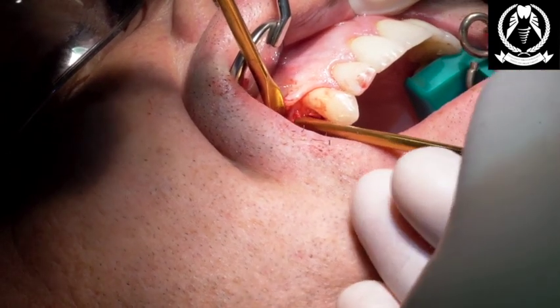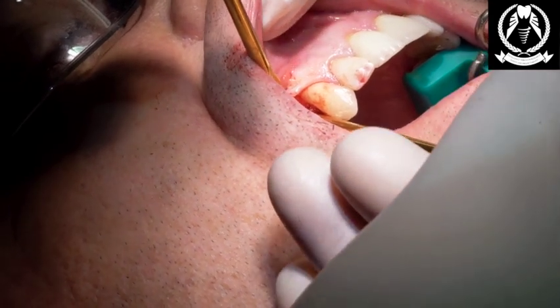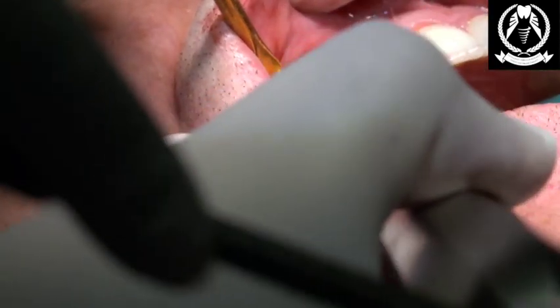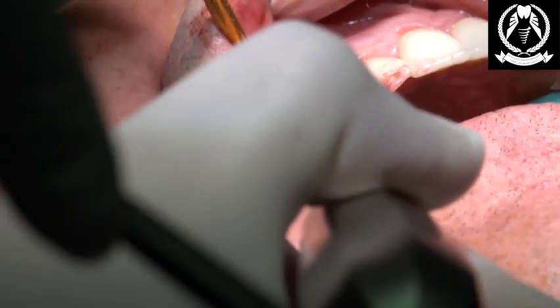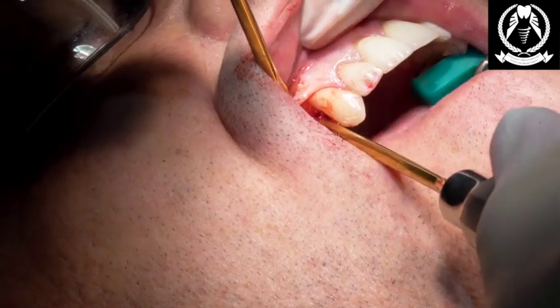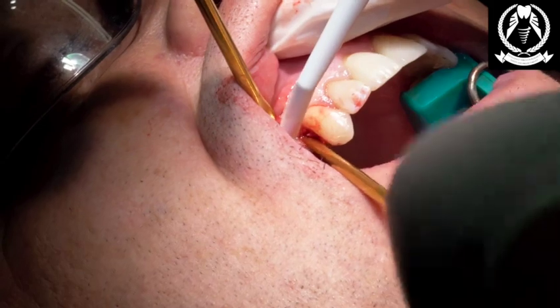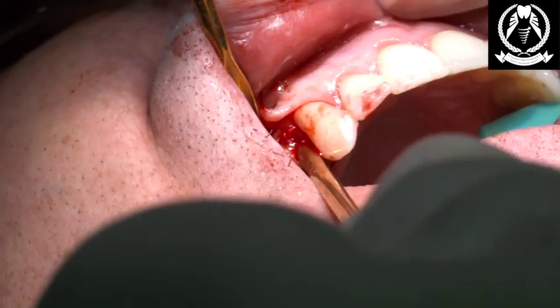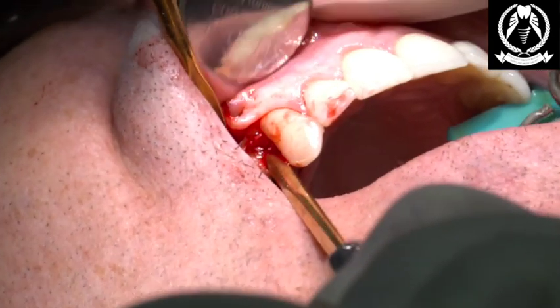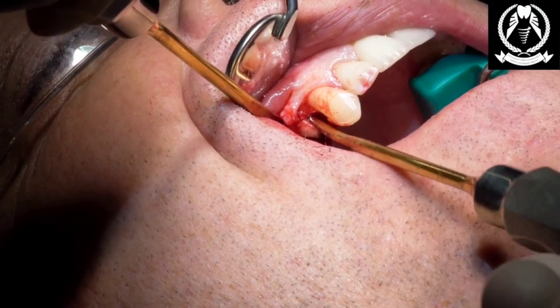Right, I need to get right down to that ligament. So a bit more tapping on this premolar. All the time looking at that buccal bone. You got it. You got it. Yeah, that's definitely better. Okay, so we're just gently expanding that root field. So I'm just taking my time over this extraction. We're taking ages.